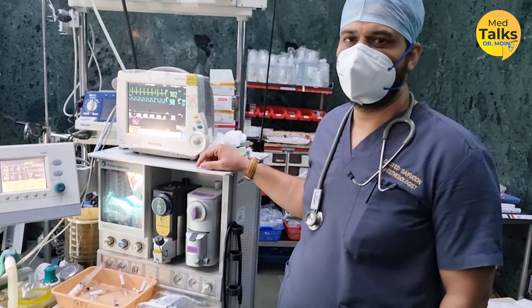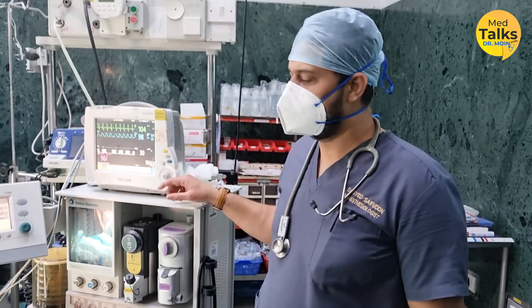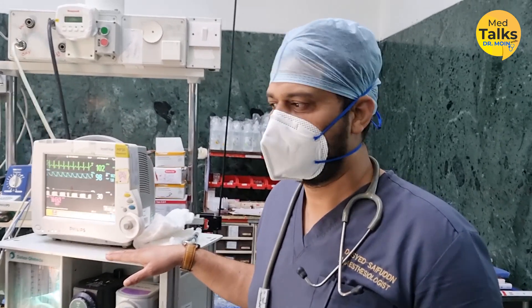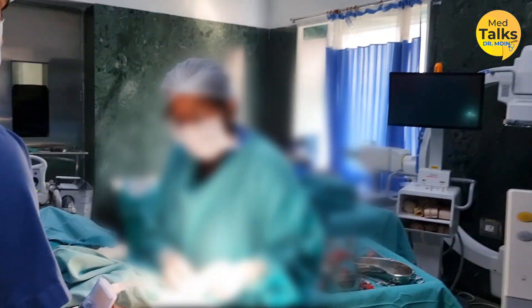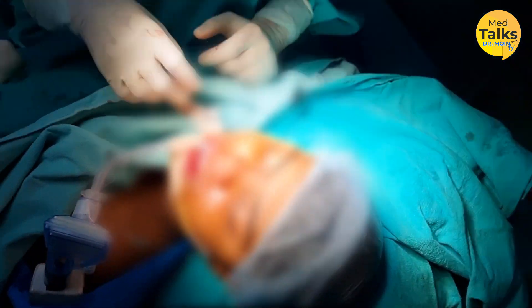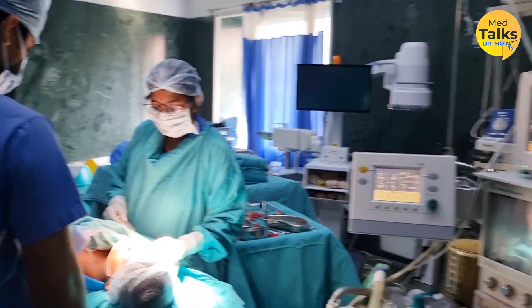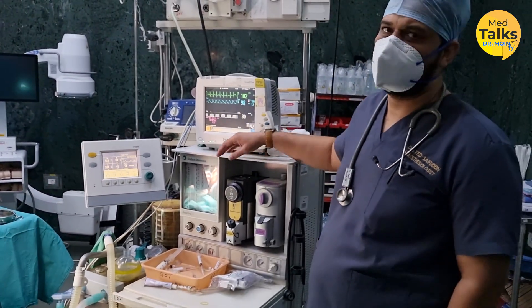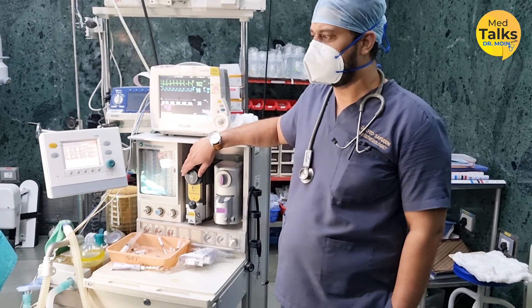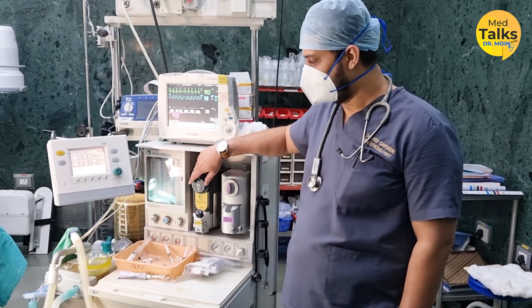Can I interrupt you for a minute, sir? Yes. Sir, you use this machine to give general anesthesia? Yes, this machine is used to give general anesthesia. We have got a 12-year-old kid posted for adenoidectomy, and we have given GA — general anesthesia — for this patient. We have used sevoflurane as a volatile agent for maintenance, because it's more tolerable for kids of this age.